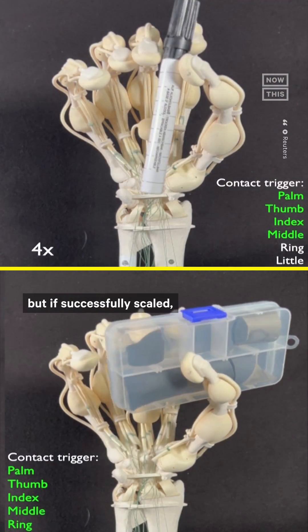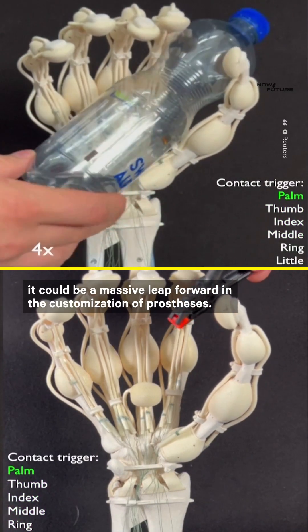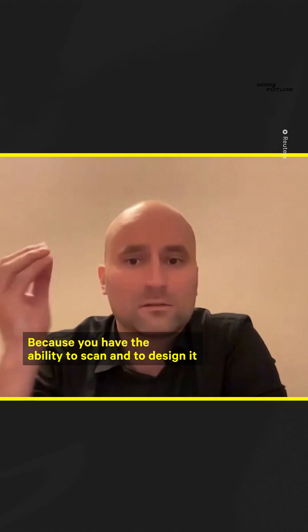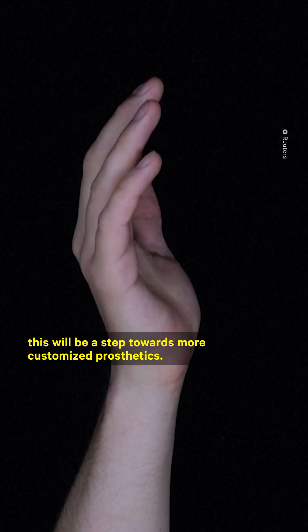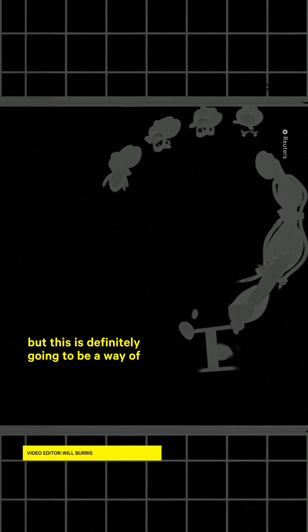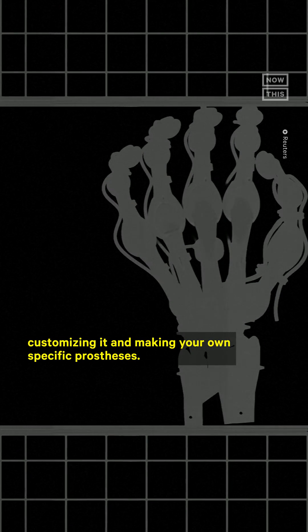The hand isn't available for production yet, but if successfully scaled, it could be a massive leap forward in the customization of prosthetics. Because you have the ability to scan and design it individually for the person that needs it, this will be a step towards more customized prosthetics. We obviously have lots of work to do from a medical perspective, but this is definitely going to be a way of customizing and making your own specific prosthesis.